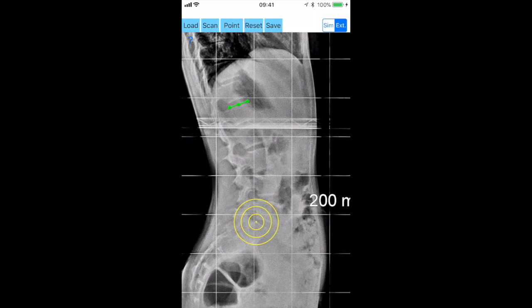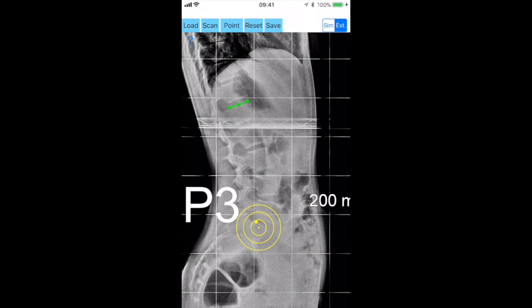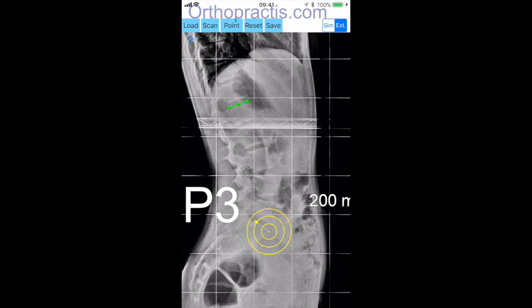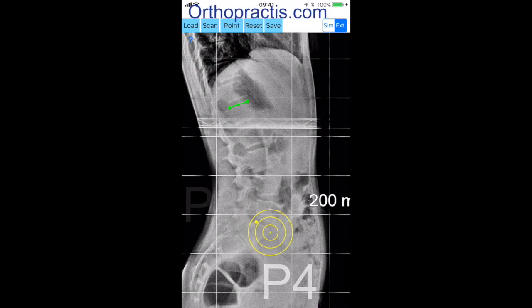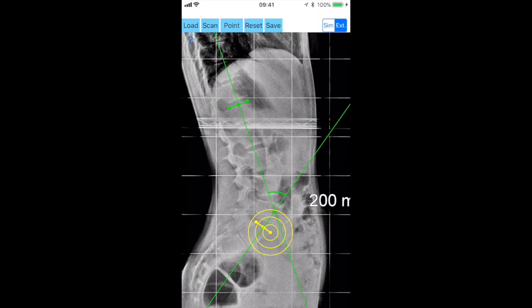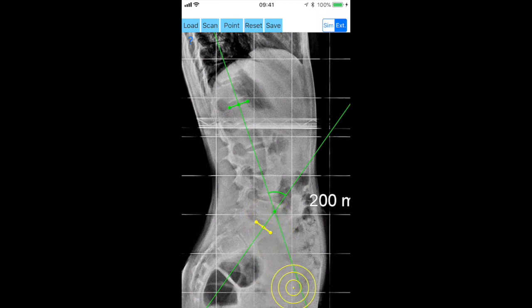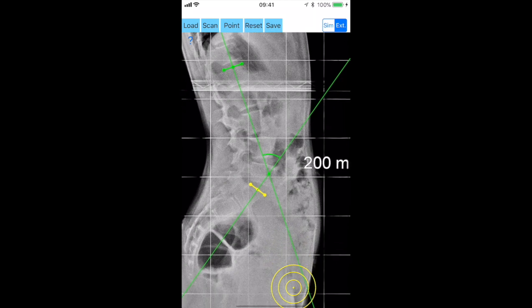With the transparent circular template you aim to locate the posterior corner on the top margin of S1 of the sacrum, and by clicking the point button the point P3 is marked. By clicking also the point button at the anterior corner of the superior end plate of S1 vertebra, the point P4 is marked.